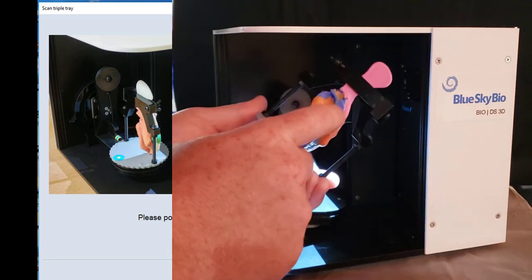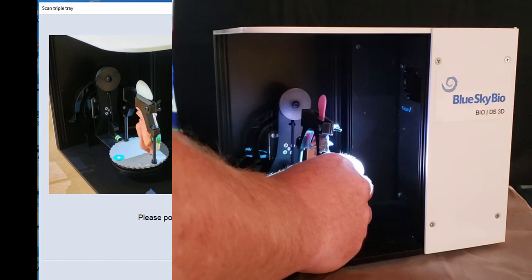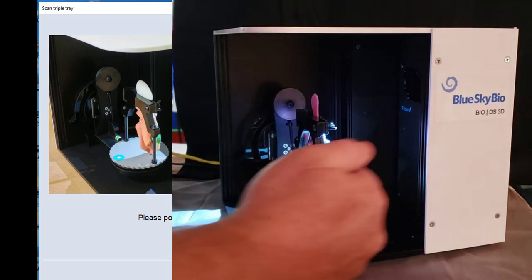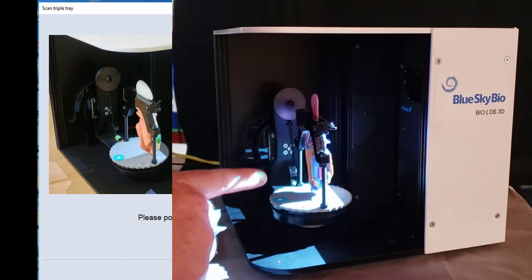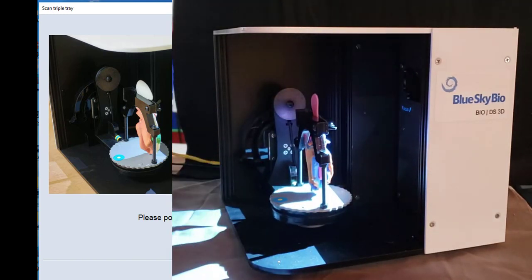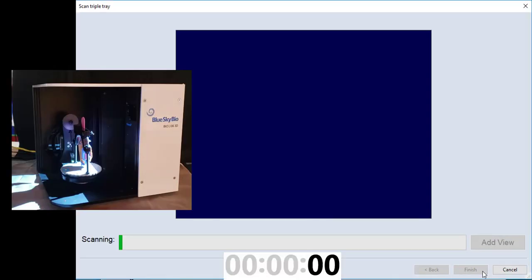But we're going to put the maxillary side facing the camera, the blue and yellow dot facing away from the camera, orient everything, make sure that the arm for the scanner is going straight up and down in this direction, and the blue and yellow dot is facing away. With that done, we can click Next and begin the scanning process.